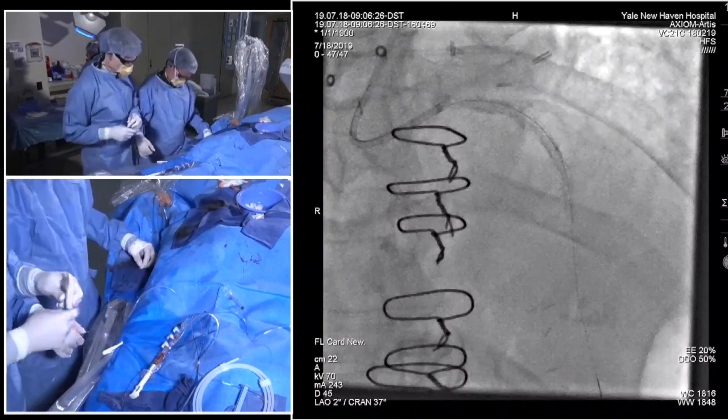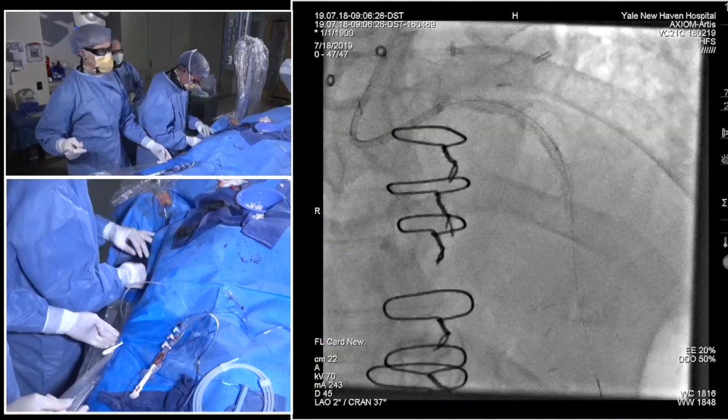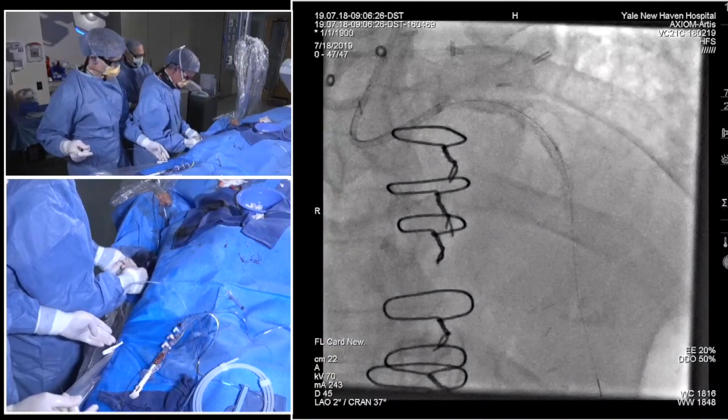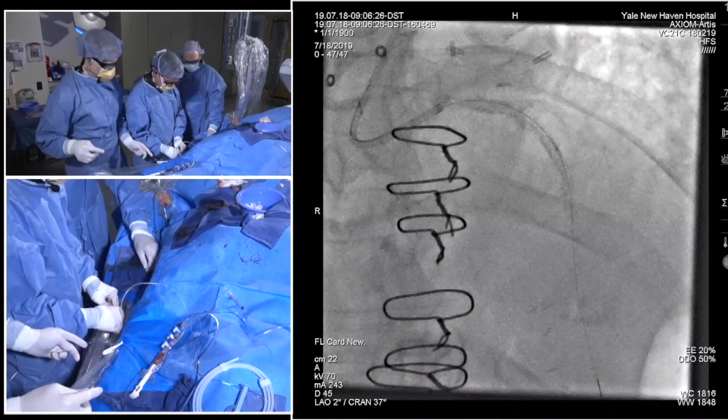So we're running up on, it said 2 minutes on the clock. So maybe just a quick IVUS run? Yeah, that would be great. That's next up here.